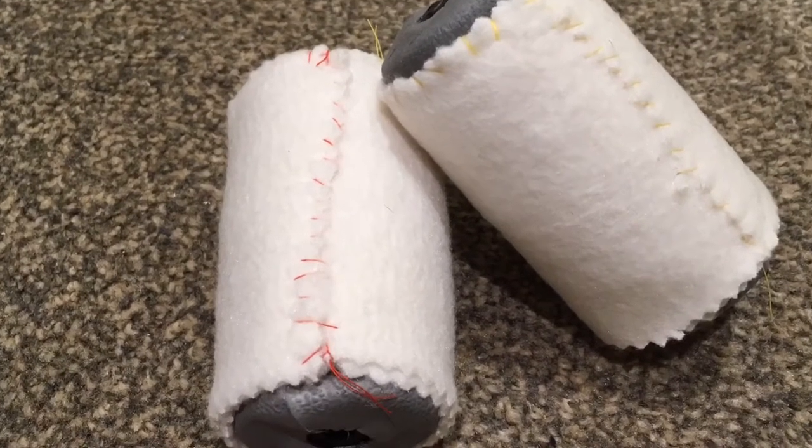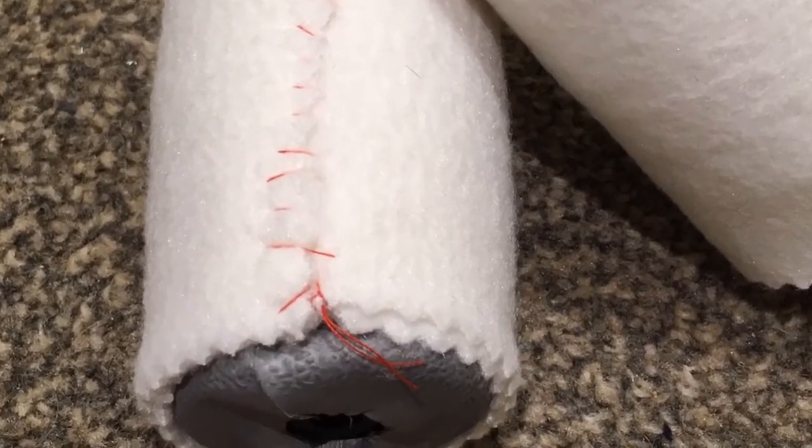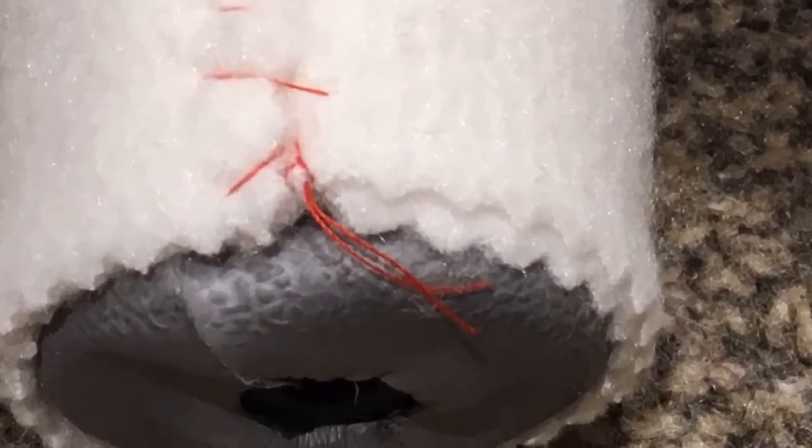Next I worked on padding the hand grips using polar fleece, which I cut into strips that were the right width and then wrapped very tightly around the hand grips and then stitched into place by hand.